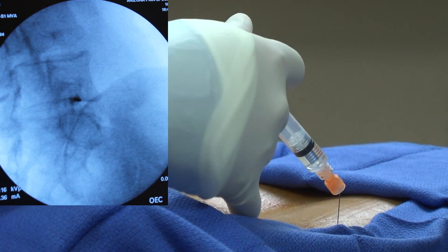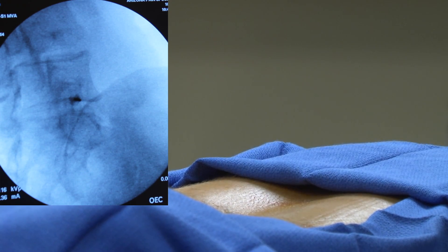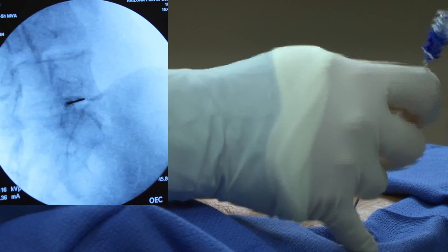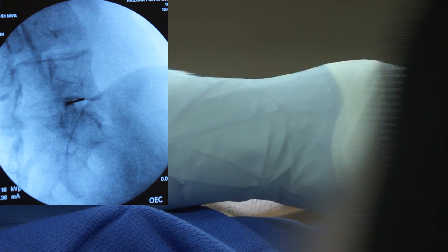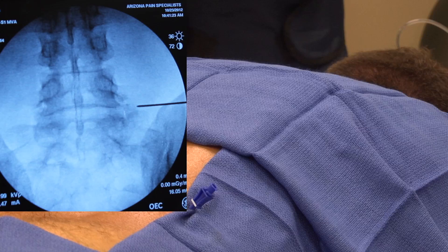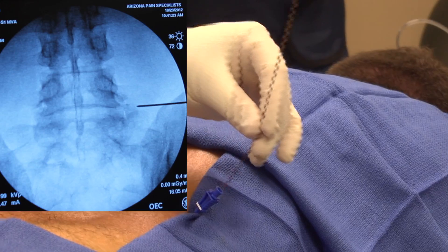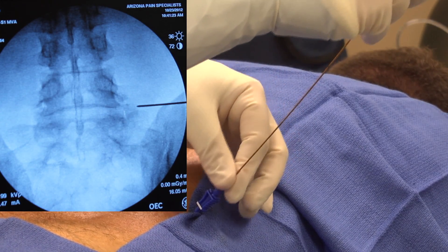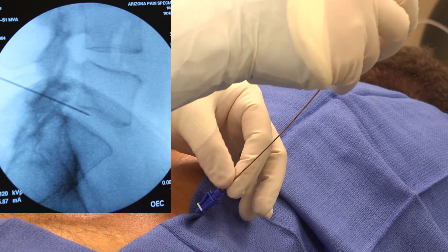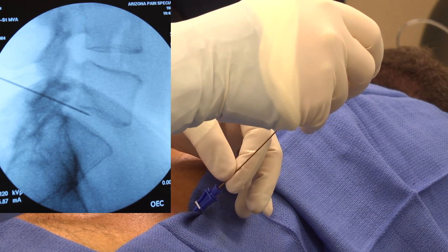This procedure involves inserting a needle into the painful disc and then applying heat through a catheter in the disc. Before the procedure, an IV line is started so that the patient can relax as needed. Fluoroscopy, a real-time x-ray machine, is used in order to assure proper placement of the needle. With x-ray guidance, the needle is then advanced to the targeted area until correct placement is obtained.